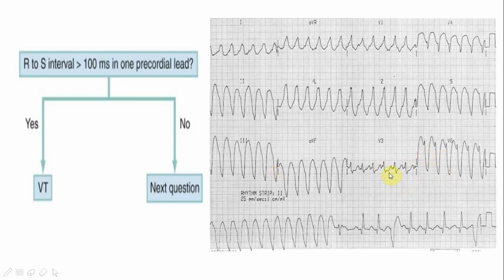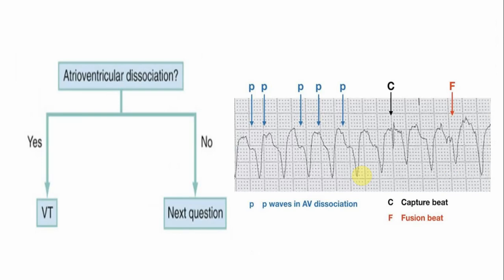If the Brugada sign is absent we proceed to Step 3: atrioventricular dissociation. In this ECG you can see P waves coming at regular intervals buried within the QRS complexes, but there is no relationship or association between the P waves and the QRS complexes. The P wave activity remains within the atria and the QRS activity remains within the ventricle — that is AV dissociation, which is a very characteristic feature of VT.